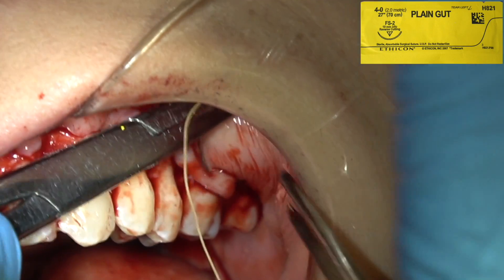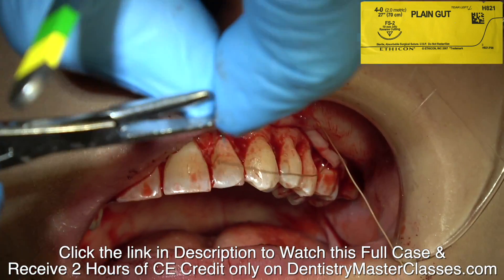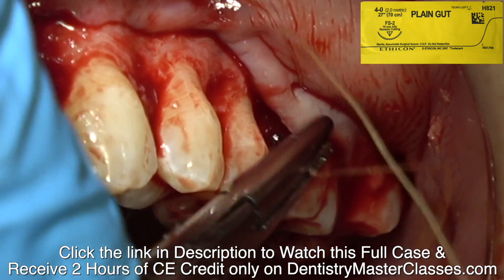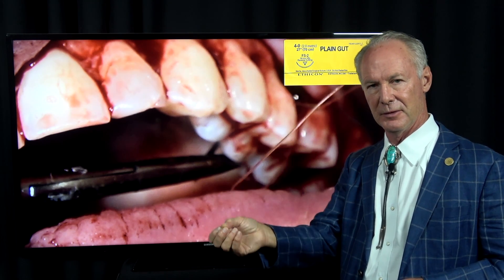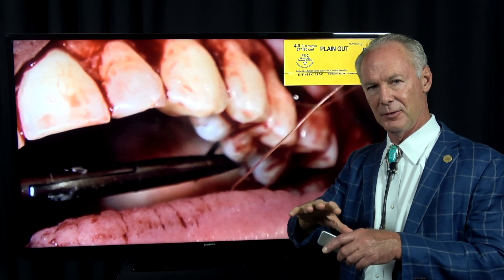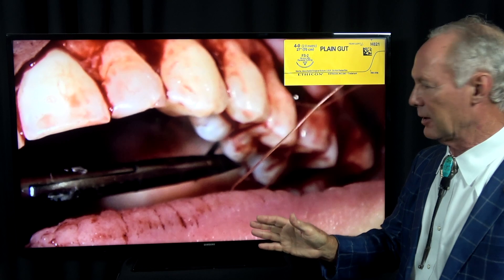When you're suturing, you can use prolene or you can use gut. I usually use plain gut, because if you use synthetic suture you're going to have to come back and remove it, and if you don't remove it fast enough the tissue will grow over it. This is going to dissolve in four to seven days and that's long enough.